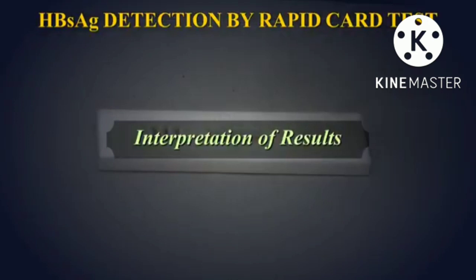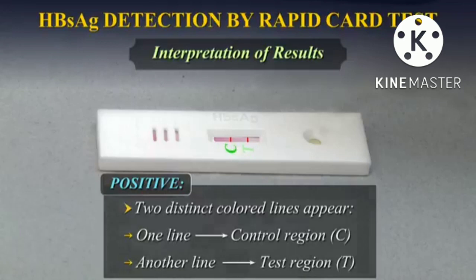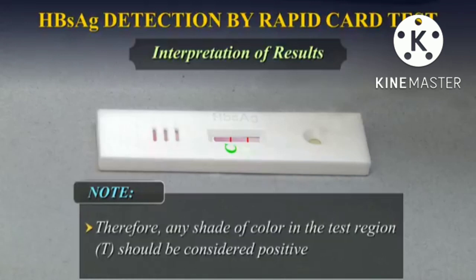Interpretation of results. Positive. When two distinct colored lines appear, one line should be in the control region C and another line should be in the test region T. Note: the intensity of the color in the test line region T will vary depending on the concentration of HBs antigen present in the specimen. Therefore, any shade of color in the test region T should be considered positive.